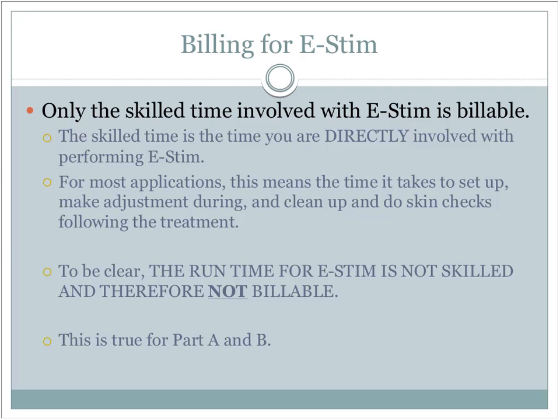So in other words, for a Part A patient, you can't put eStim on them, let it run for 30 minutes, and count 30 minutes towards their RUG levels, okay? You may have 6, 8 minutes, whatever, between setting it up, adjusting it, turning it on, turning it off, and the skin check. That's what you put in your billable time, okay?